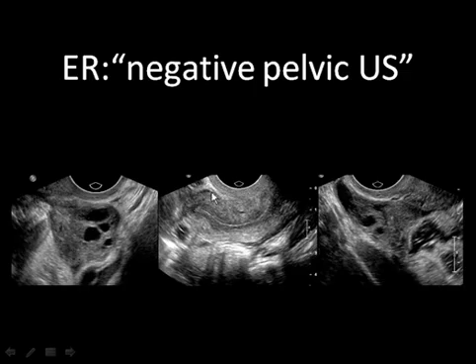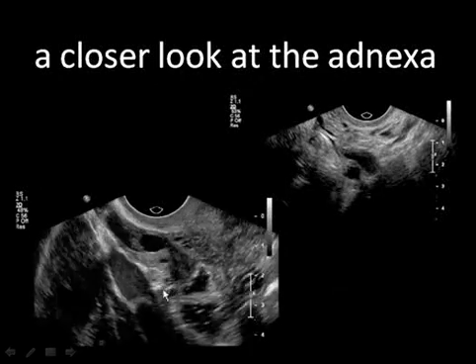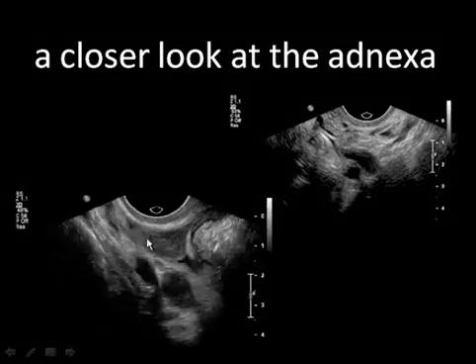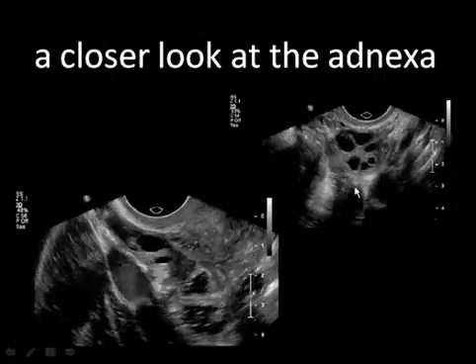And perhaps we may say in retrospect that there is complex fluid or a sliver of complex fluid anterior and posterior to the uterus. Now here we see the normal ovary, but the extra soft tissue that is above and adjacent to the ovary.